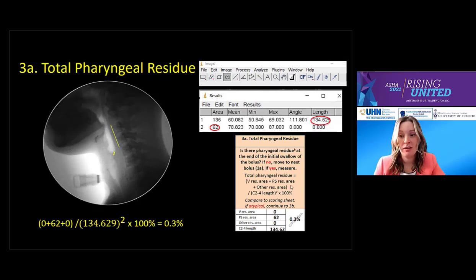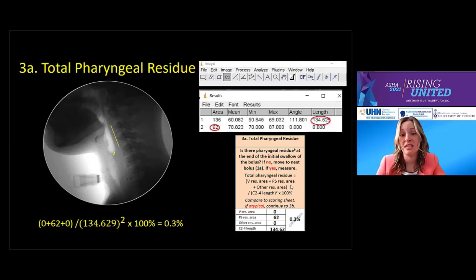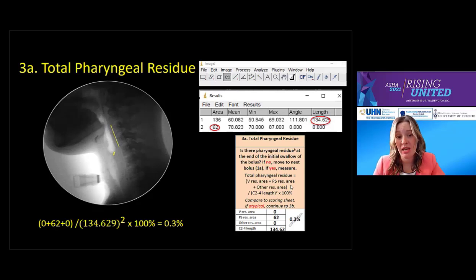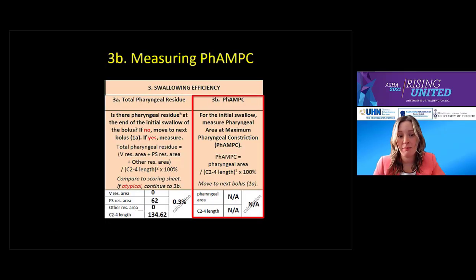Going back to our patient, using ImageJ — a free downloadable software — we measure the anterior inferior corner of C2 to the anterior inferior corner of C4 with the line tool and trace the residue. This gives us 0.3%, which is less than 1.7%, so her residue is considered typical. Because her residue is considered typical, we can skip 3B, as the patient does not present with a swallowing efficiency concern on this bolus. 3B — pharyngeal area at maximum pharyngeal constriction — may explain the mechanism of impaired swallow efficiency in patients with atypical residue values, which we will explore in our next patient case.